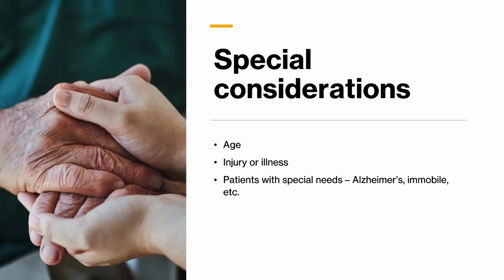There will be some considerations depending on the patient. So in older patients, you might want to make sure that they are stable, depending on whatever x-ray that you're doing. Sometimes for a setup, they're required to stand in a way that might make them feel a little wobbly, or depending on a patient's special needs, kind of similar things.